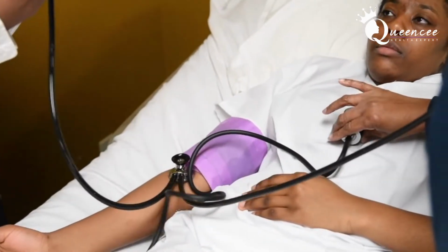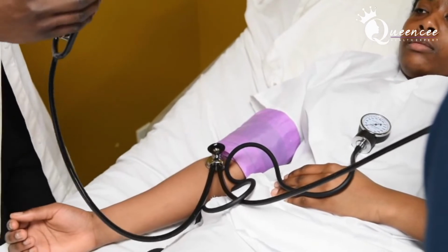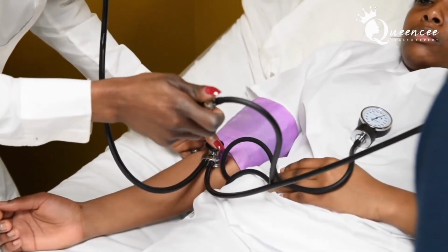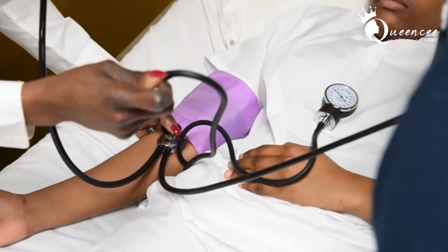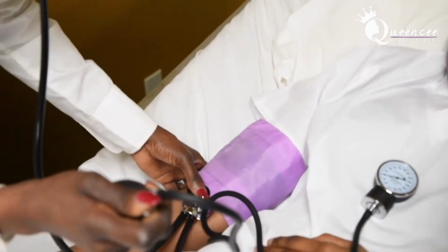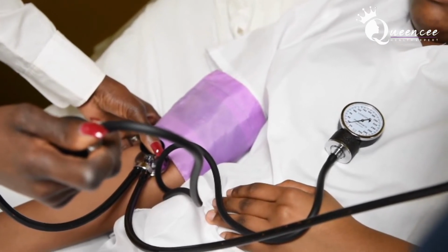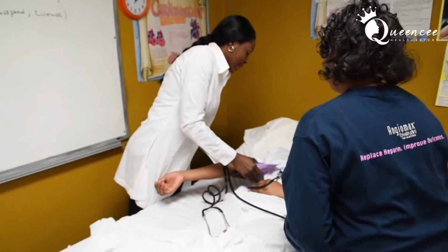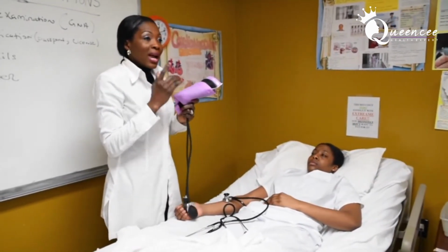Because we do not know each other's blood pressure, you were taught to pump the blood pressure cuff all the way to 180, okay? Then you start coming down. My client in this case is very young, so her blood pressure is very low. Okay, thank you. So once I'm done, I keep the number in my mind.